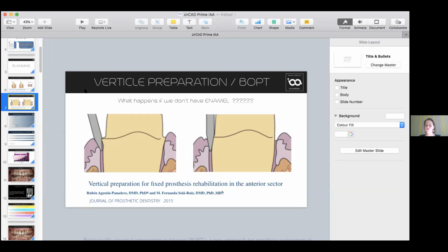You will never have a problem with these things dropping off, that's for sure. And the only other thing that I didn't say, and maybe I can just mention in 2 minutes, is the cementation of these. My choice for this sort of ceramic restoration is to use resin-modified glass ionomer, only because I know that these cements are well-tolerated subgingivally. That's what I like about them.